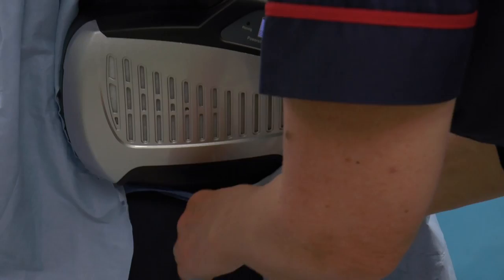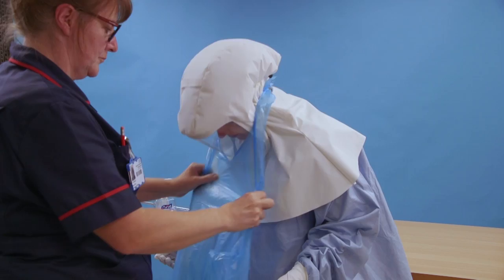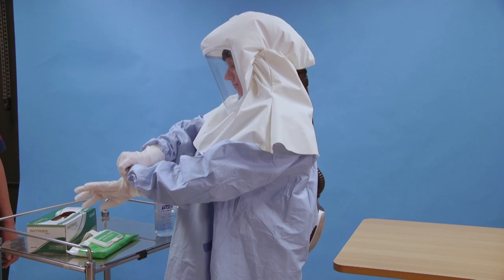The hood sits over the top of the gown. If an apron is needed, you will need to break or stretch the necktie to get it over the hood. Your buddy can help to tie it, ensuring it does not obstruct the respirator. If wearing gloves, first clean your hands, then put on your gloves. You are now ready to leave the donning area.